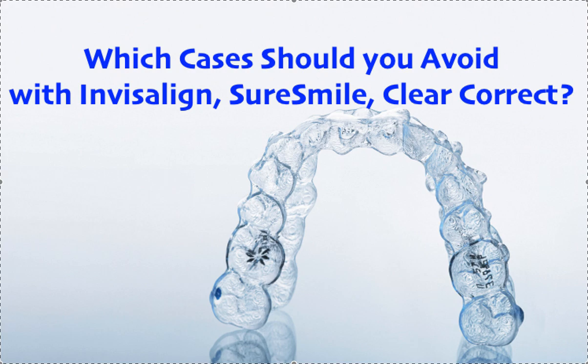Maybe later we can start scaling it down to moderate once you get all your process and SOPs up and running and your virtual check-ins, whether you're using in-hand dental, you're using dental monitoring, you're using Invis-Virtual. I don't really care. There's a bunch of different ones that are out there. Gotta have that going before you start scaling down. And that's pretty much it.